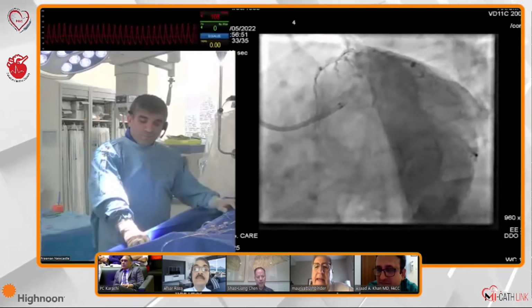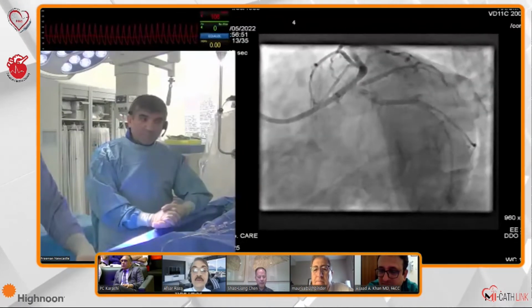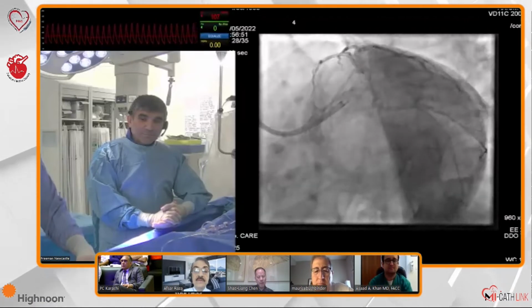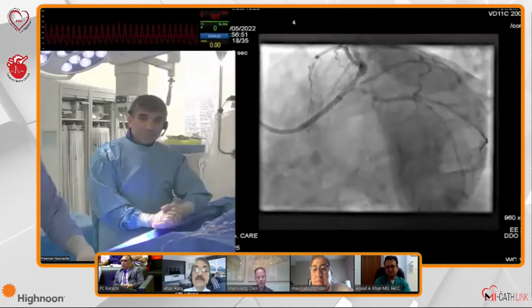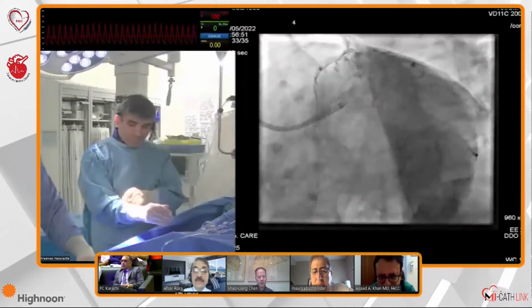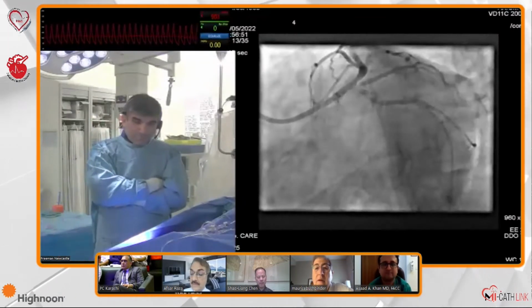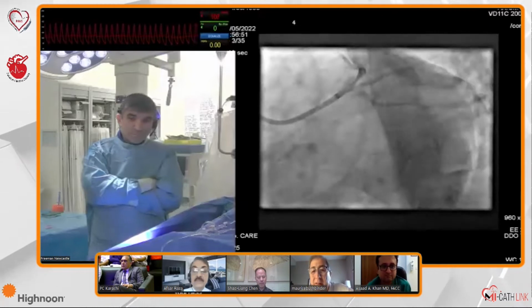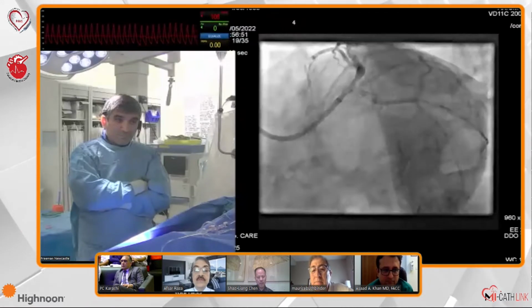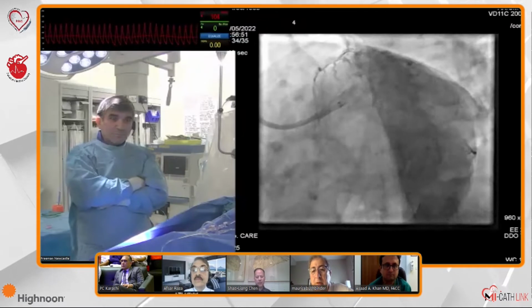Sure. Yeah, I think in this kind of case, I would definitely first use a balloon. I'll wire all 3 and balloon, and then take it from there. I'd probably need to do a 2-stent strategy. I'd probably do a DK crush after preparation, probably a stent in the circ and a stent in the left main LAD. And then probably rescue the ramus by opening up the strut of the circumflex stent.